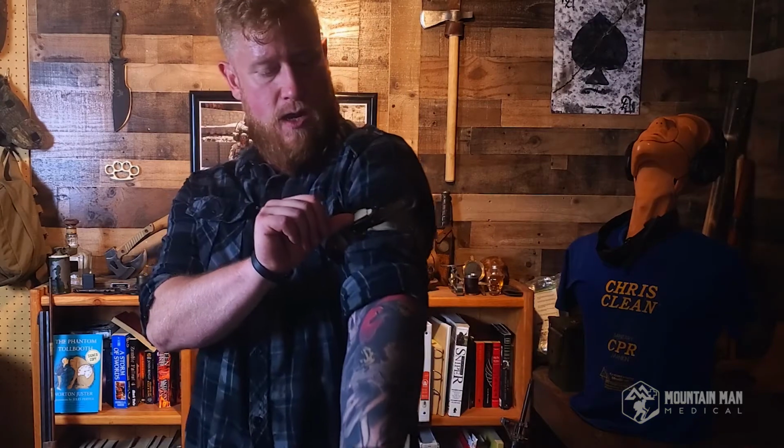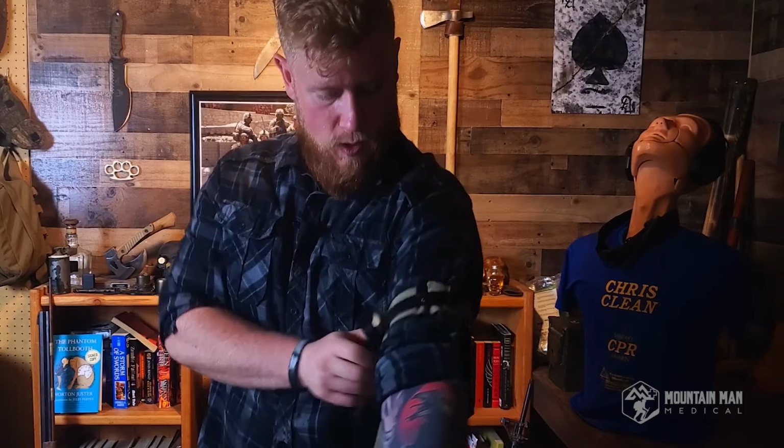Now, we want to get it off. How do we do that? Simple method. There's a little tab here. You just hook your thumb, a finger, whatever, this white tab right here, lift up on it, and it releases the tourniquet, which you can then pull off.